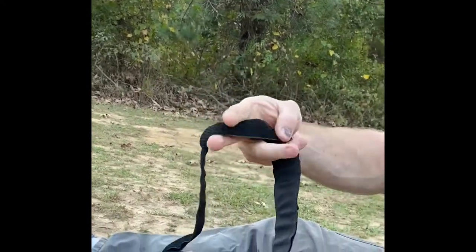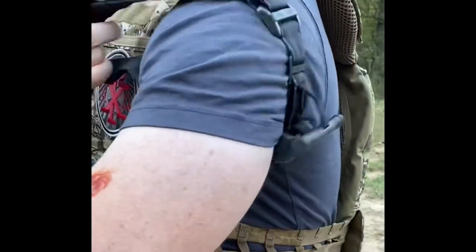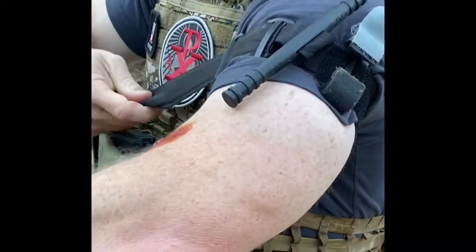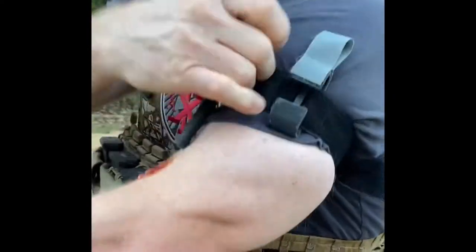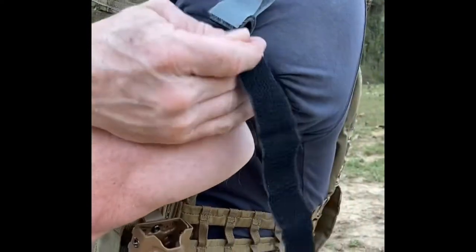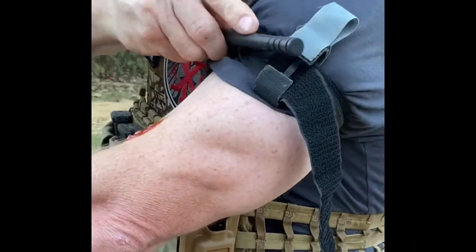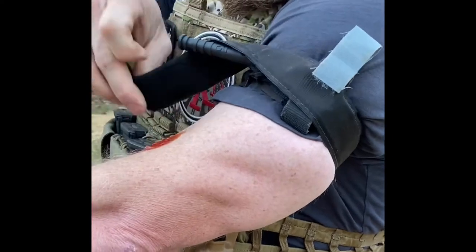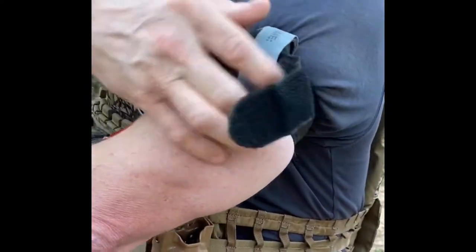Make sure the red tip is facing you. Thread it before the windlass buckle, then turn — one, two, three, or however many it takes to get the blood to stop. Then wrap this around just to get it out of the way, and then apply your time.